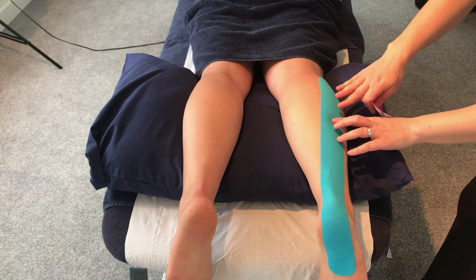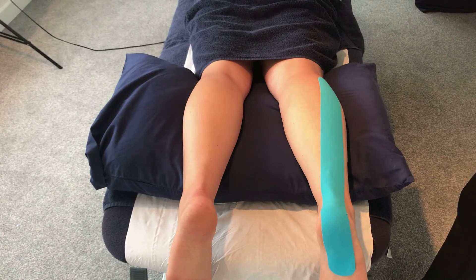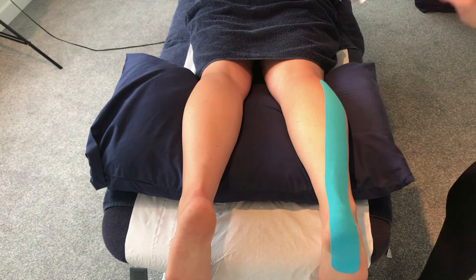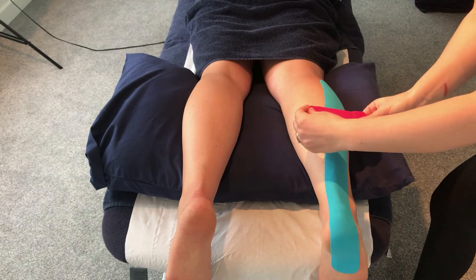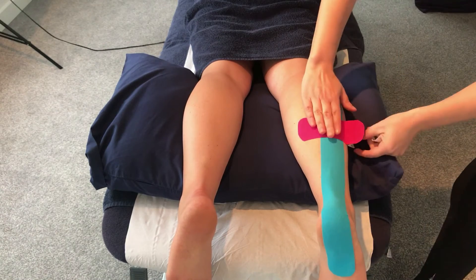From there, we want to do the desensitization taping. We've found the area of pain, take the tissue into a stretch, apply light tension on the tape breaking it from the center. Relax the foot to attach both anchors down, then rub the tape to stick it down.